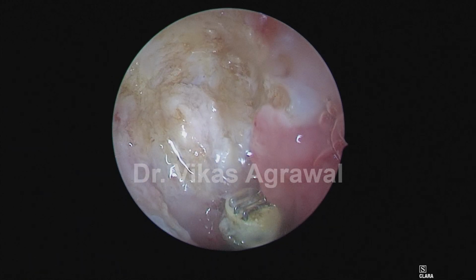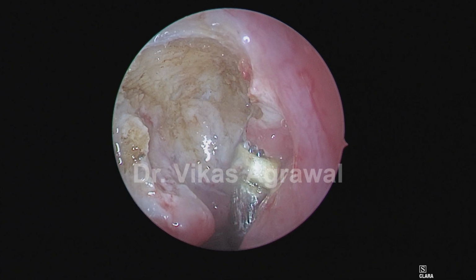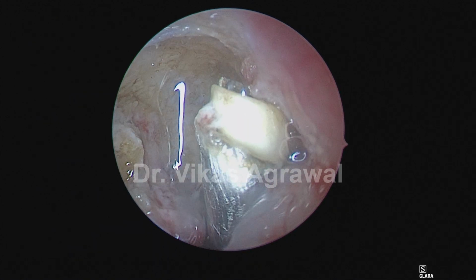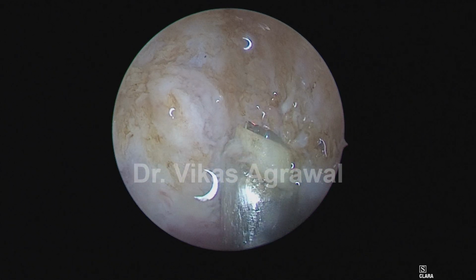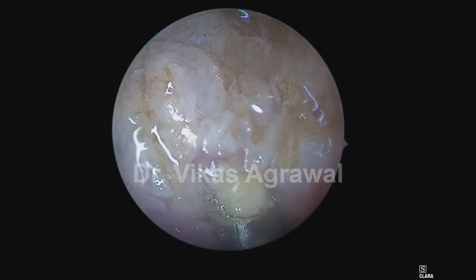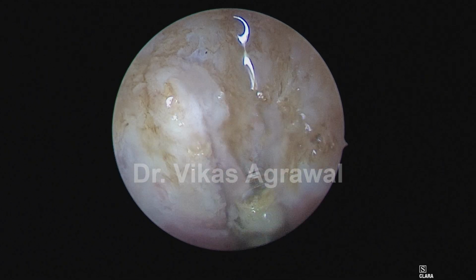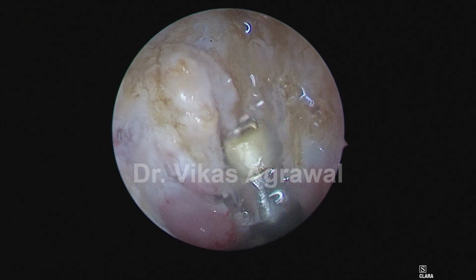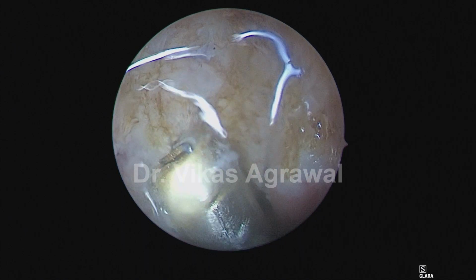We go behind the torus. Now you can see that there is still a little lymphoid tissue on the torus tubarius. We'll remove all these tubal tonsils completely so that they do not regrow. Now we'll go behind the torus, remain medially. We'll direct our wand medially at this point because laterally you can open up some vessels, which we obviously do not want to do.